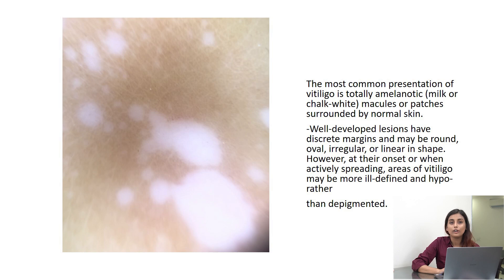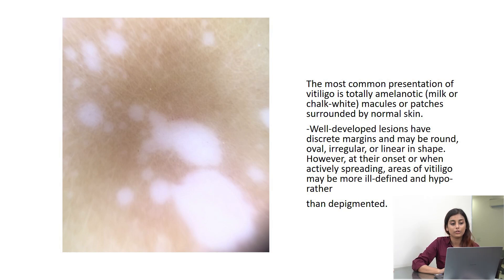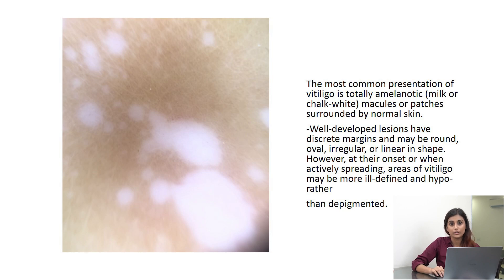If you talk about vitiligo, in vitiligo we have chalky white hypopigmentation — the areas are completely white. Besides that, they'll have a good border or boundary which we can clearly demarcate. It can be irregular, linear, round, or oval, but we will be able to clearly demarcate it.